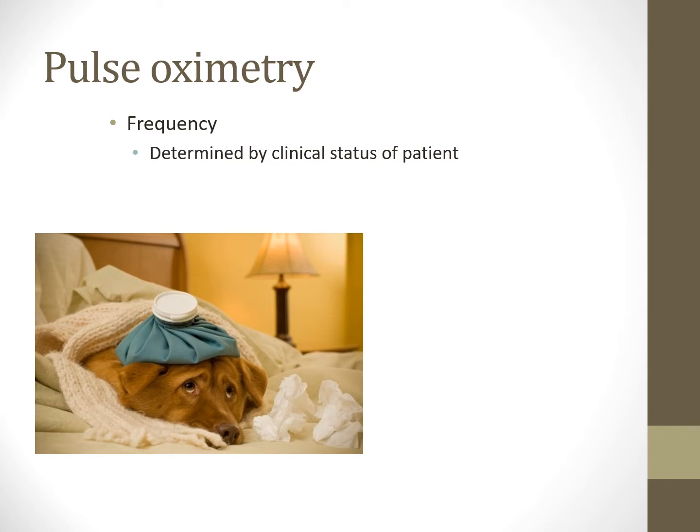So if I had a total knee replacement, so let's give you a scenario. If I had a total knee replacement and I'm up in the orthopedics unit and I'm on a lot of pain medicine, would I be indicated for continuous pulse oximetry?